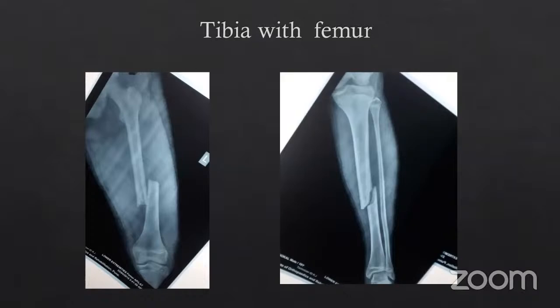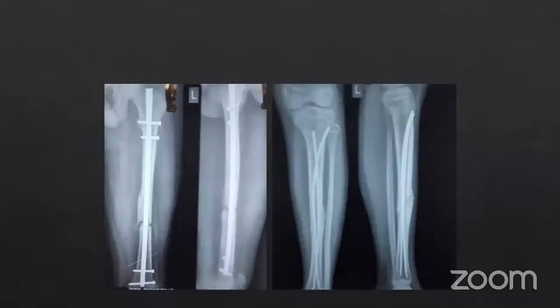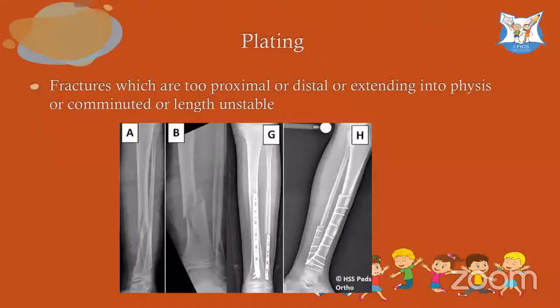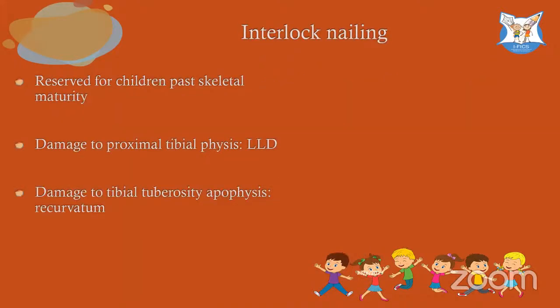Ipsilateral polytrauma, a femur with tibia. So adolescent femur and tibia. So elastic nailing for the tibia and an interlocking nail done by my adult colleagues for the femur. That is how we did this. That is how it healed. Plating. Plating is essentially for juxta-articular fractures, either too proximal or too distal near the epiphyseal plate. Or length unstable fractures. Again, length unstable is one of the indications where a plate may be used.